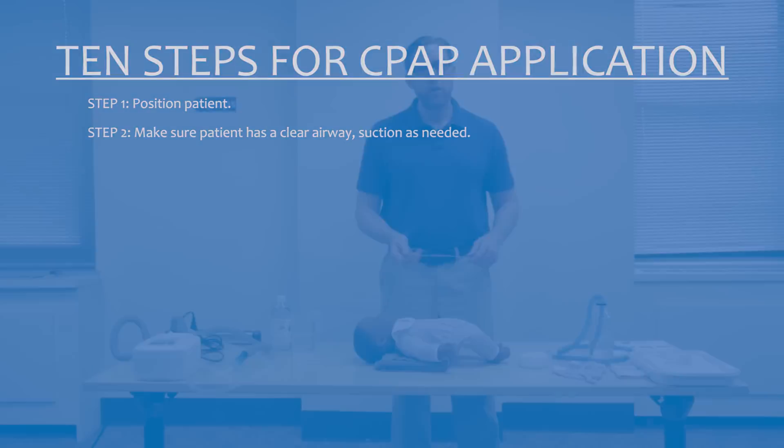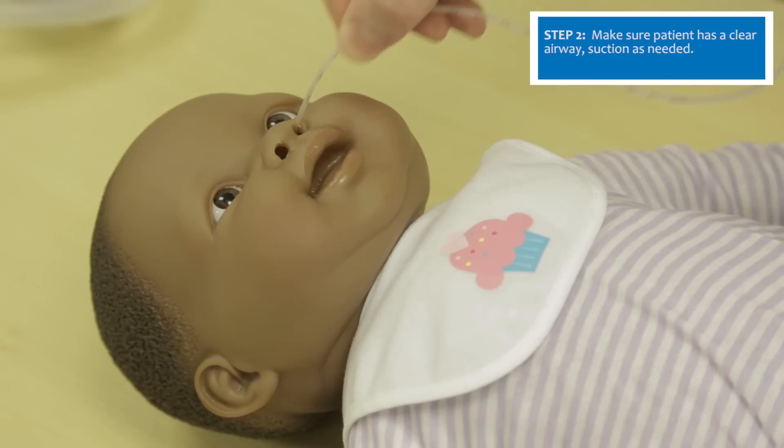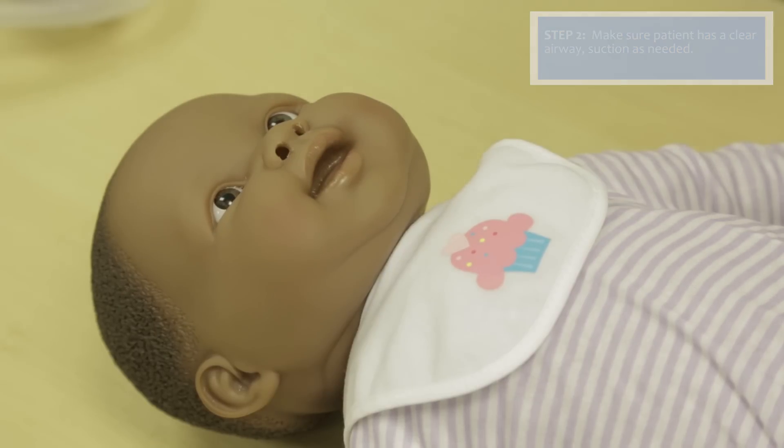For CPAP to work, it's important the patient has a clear airway. Use a suction catheter to gently remove any mucus or obstruction from each of the nares. This will ensure the patient has a clear airway and CPAP can be delivered efficiently.